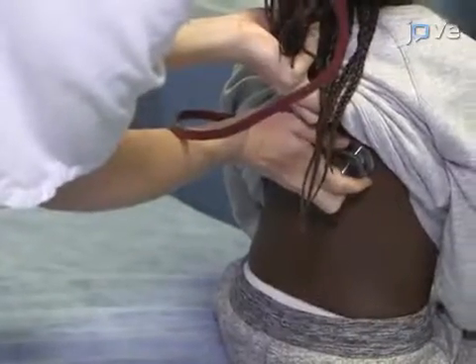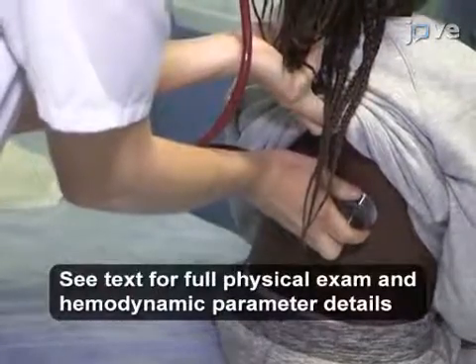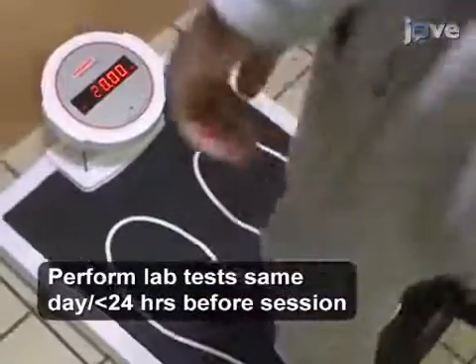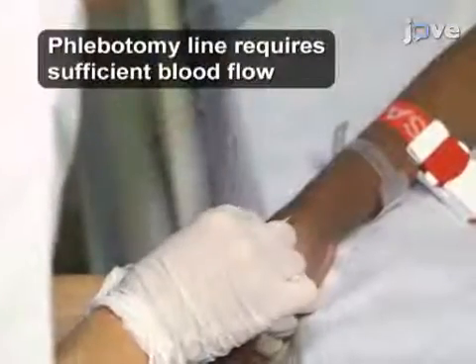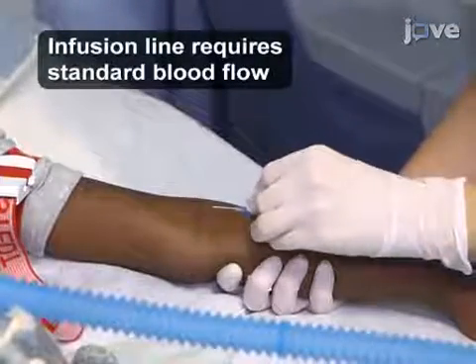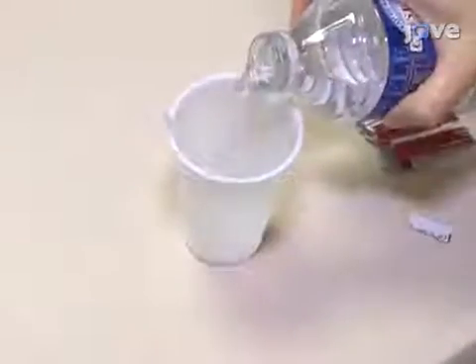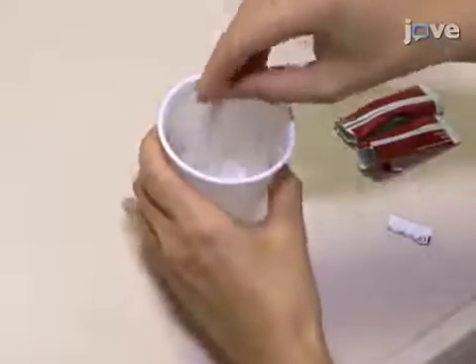Before beginning the exchange transfusion session, have a physician perform a thorough and complete physical examination of the patient, paying specific attention to the body temperature and the hemodynamic parameters, and obtain a recent body weight. Install a peripheral venous line to one limb for the phlebotomy and a second venous line to the other limb for the albumin and packed red blood cells infusion. Then administer one gram of calcium per OS to prevent hypocalcemia due to the presence of a calcium chelating anticoagulant in the transfusion bags.